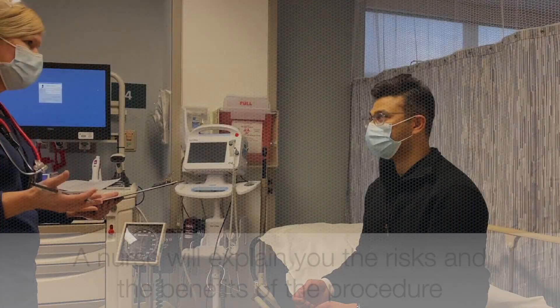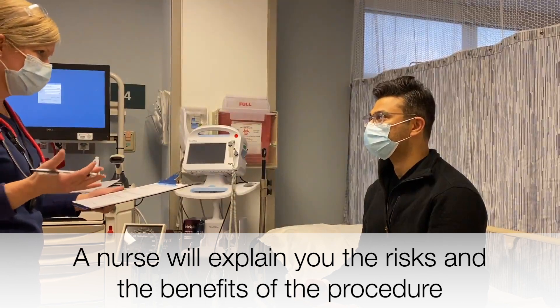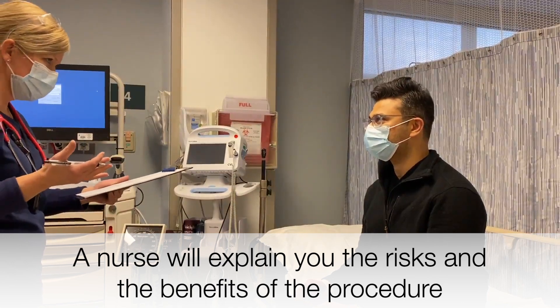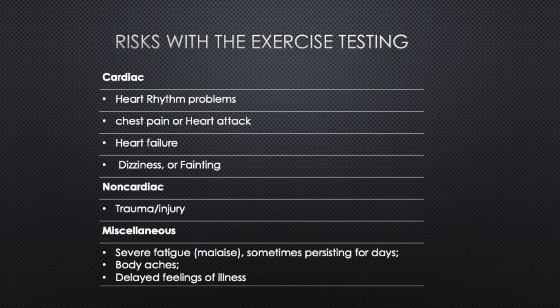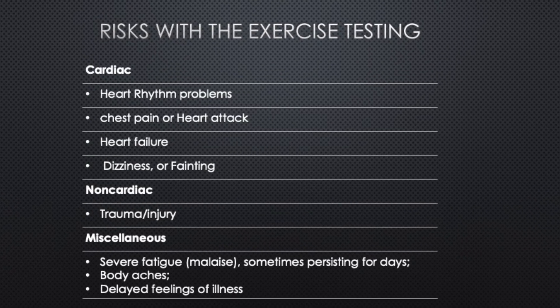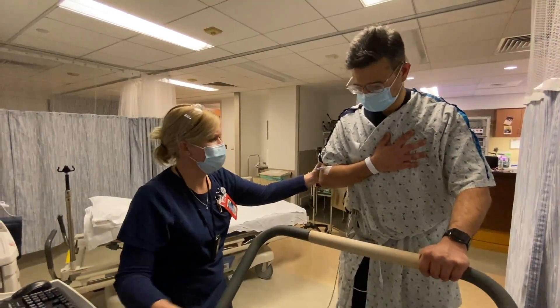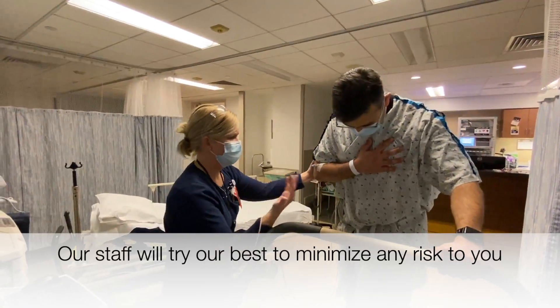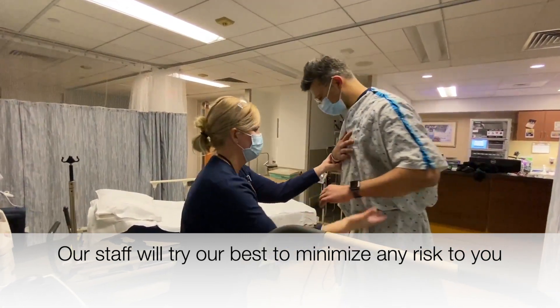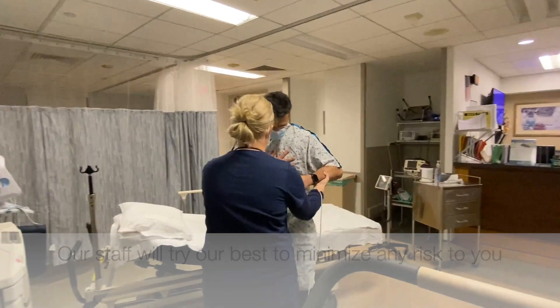Before we start, the nurse will explain the risks and benefits of the test. This test is done routinely, but as with every test, there are potential risks. The most common risk is chest pain. Other risks include dizziness, nausea, or rarely an allergic reaction to medications.